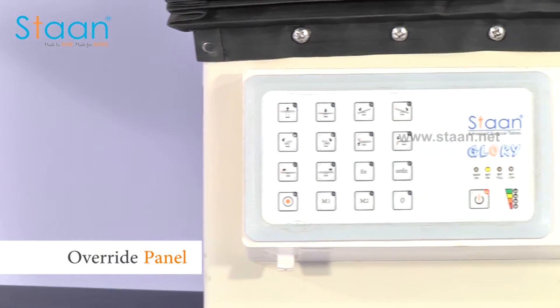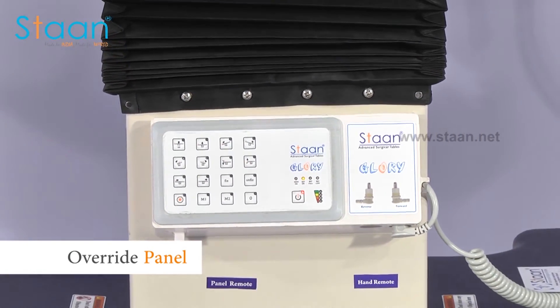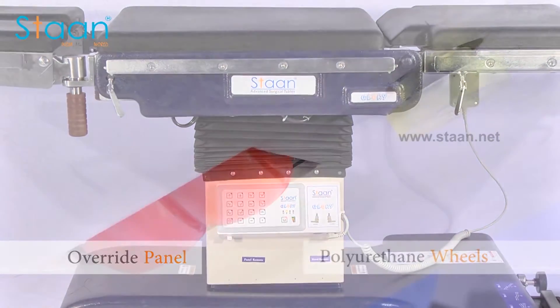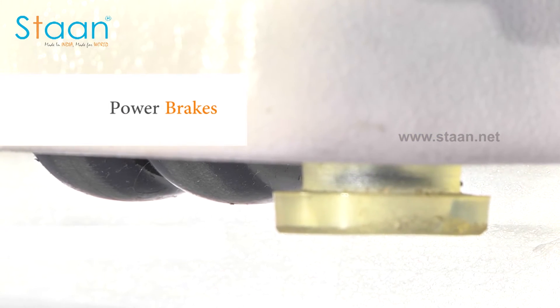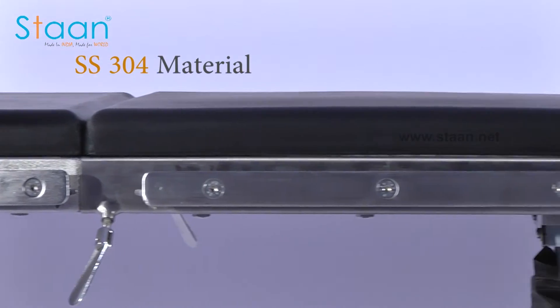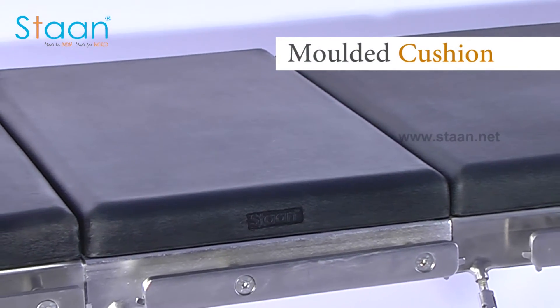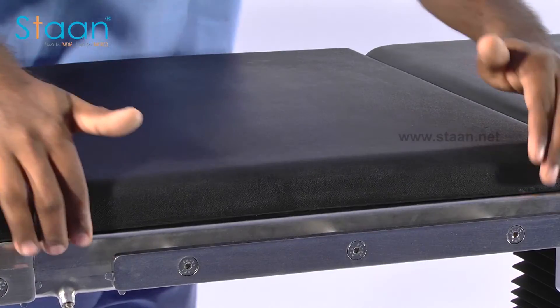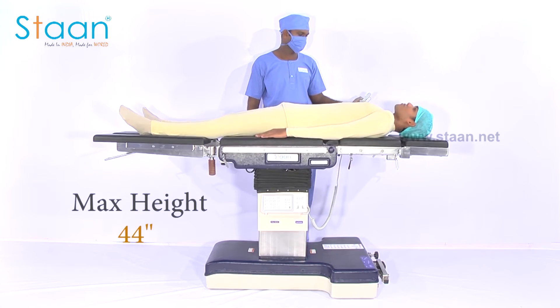An easy accessible override panel with user-friendly instructions is available in case of failure of the remote. The entire table is mounted on four twin disc central caster wheels. Four powerful hydraulic brakes are present in order to prevent unintended movements. The entire top is constructed out of high quality SS 304 grade material and covered by stitchless polyurethane molded cushion. A specially designed safety lock system ensures safe fixation of the attachments. The top is covered with radiolucent strong fiber material to provide C-arm compatibility. Height can be customized based on customer requirements.